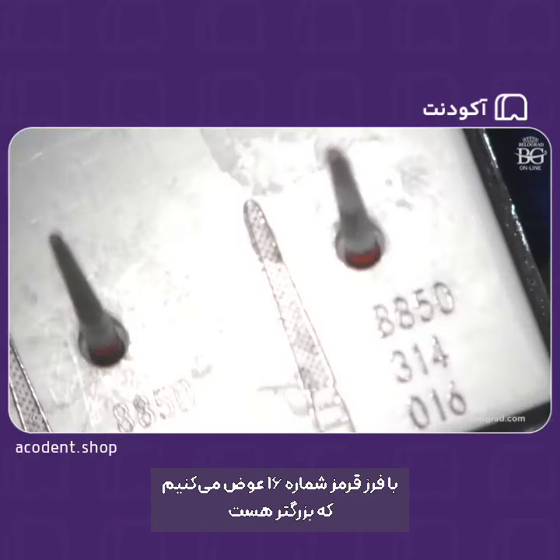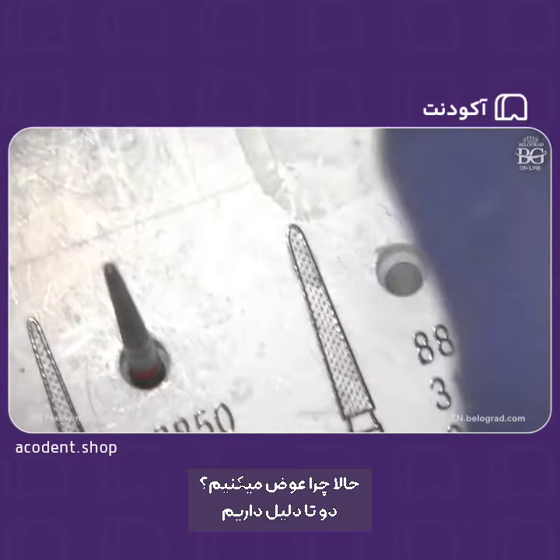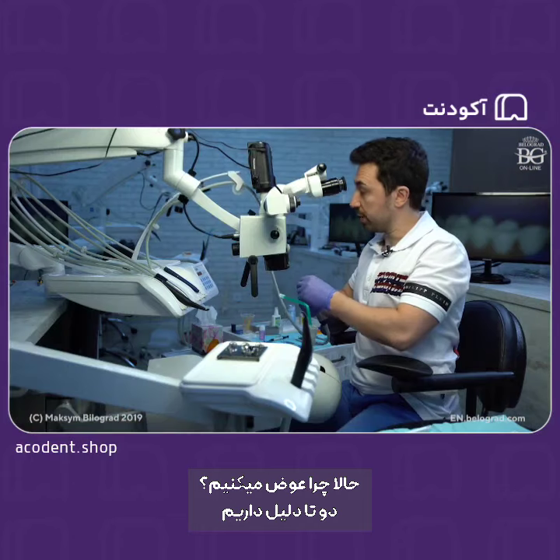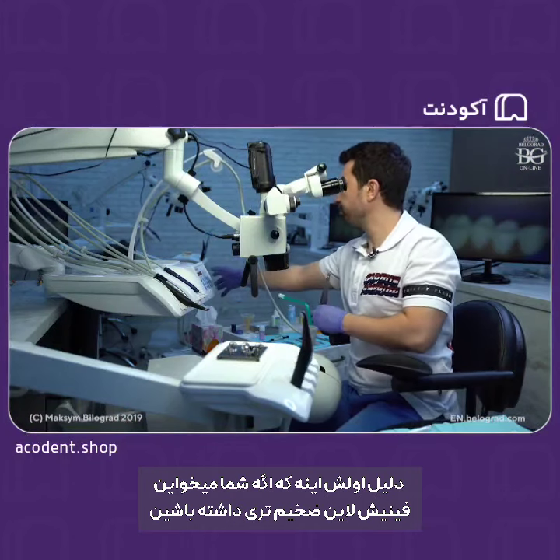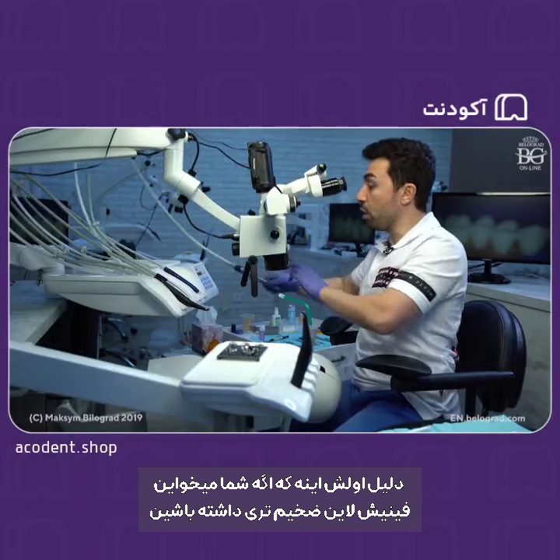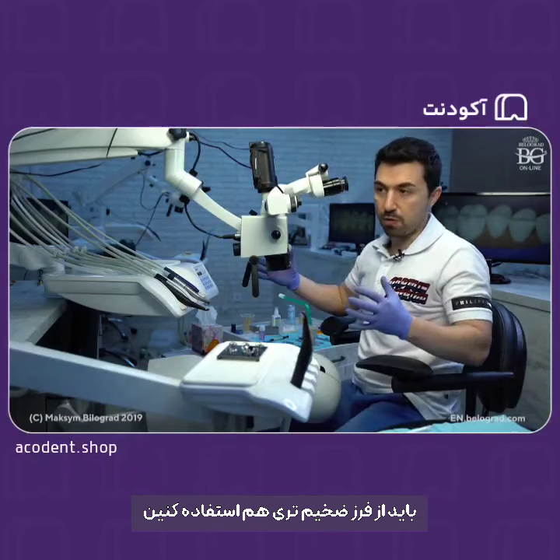Let me show you this one. We'll take this one now. Why do we change it for the bigger size? There are two reasons. The reason number one is if you want to make, for example, finish line thicker, you can do it with a thicker burr. Okay?